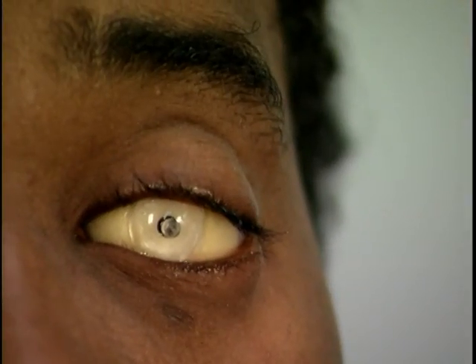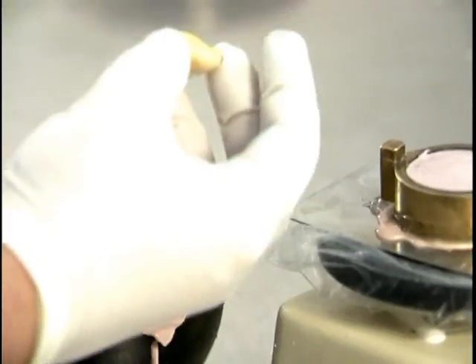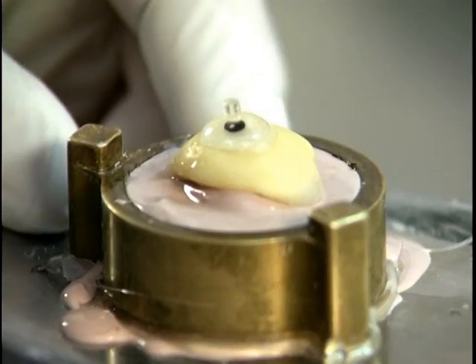Introduce the iris button to the wax master to check the gaze and motility. After the wax master fitting, the master mold is made using a lab stone. Note that making the master mold is the same process as making a lab plaster mold.